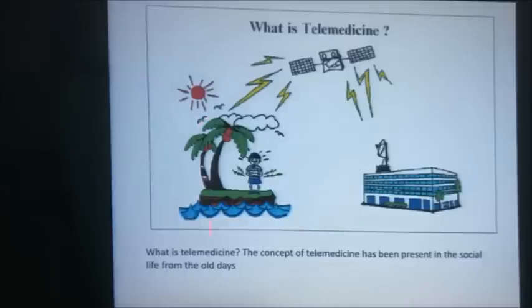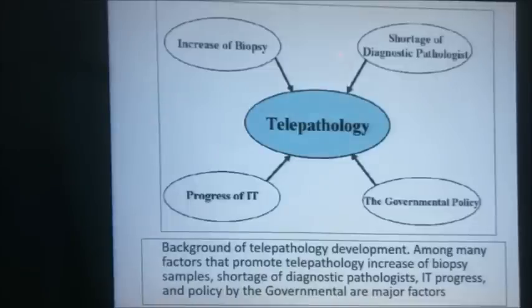You can diagnose while you are away, but unfortunately you can be nagged and irritated while you are on holiday, okay? So this is telepathology. Why is telepathology a good idea? Telepathology is the current use of pathology online. You can report online without the use of a microscope. You can report anywhere. You can consult anyone in another place.